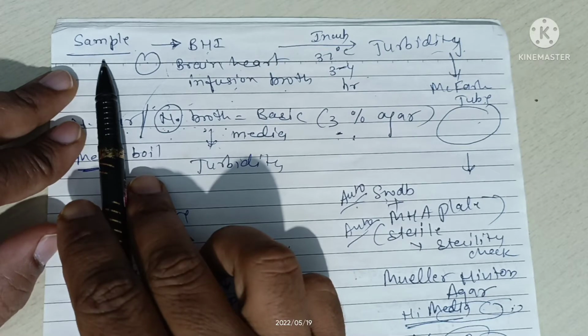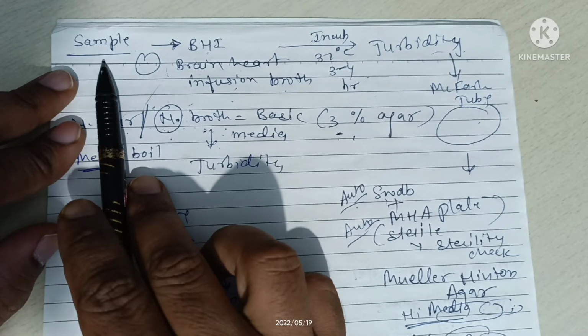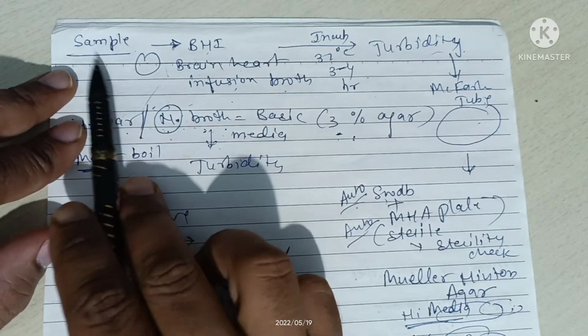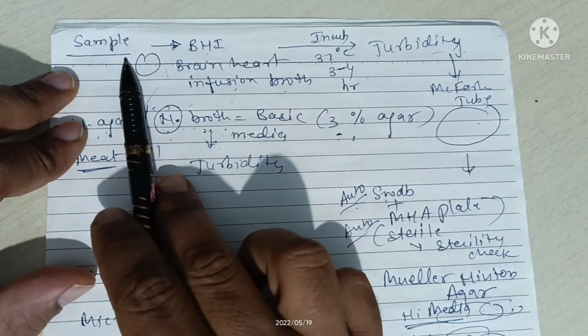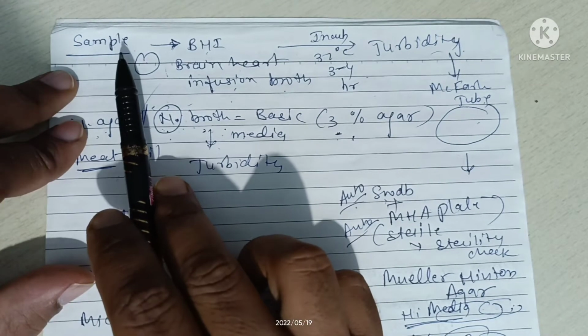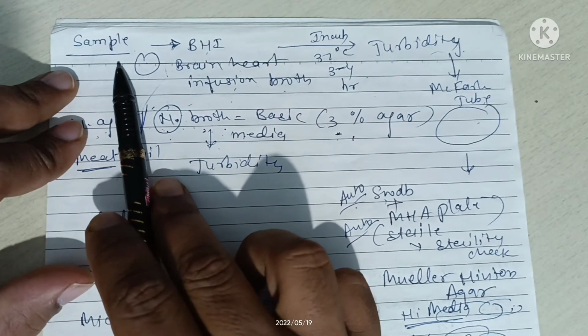It should be collected and immediately placed at 4 degrees centigrade in the refrigerator, or transported in chilled material. The sample is collected either by swab or as a whole sample, then transported in a refrigerator or chilled at 4 degrees centigrade.